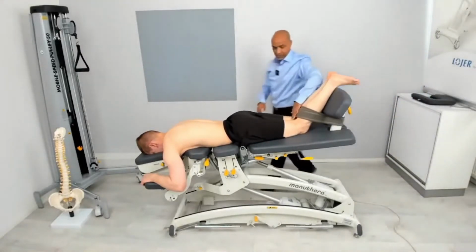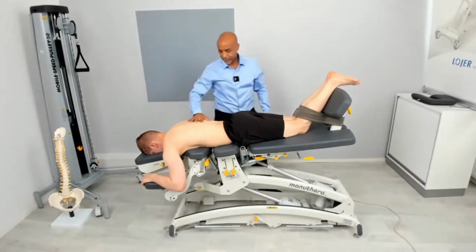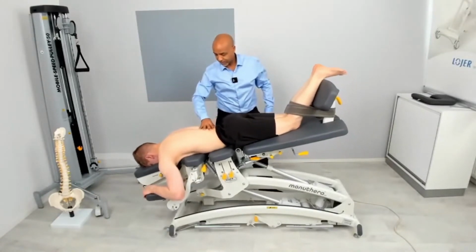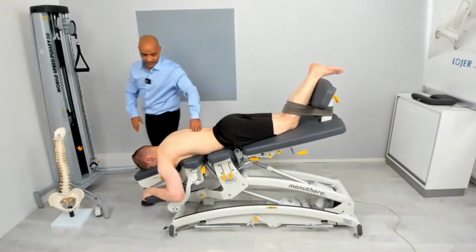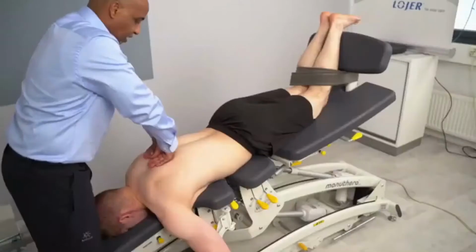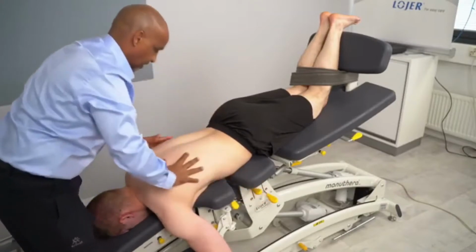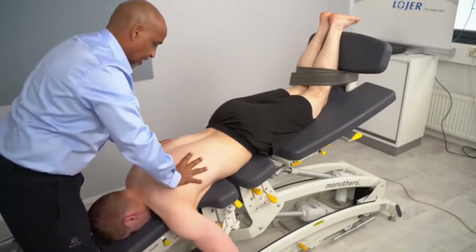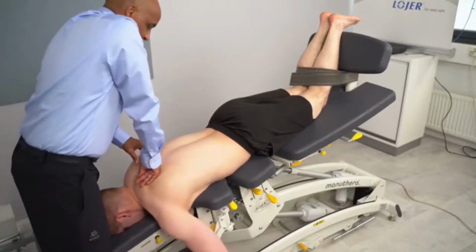This harness will help to increase the range of tilting. So now I have added more traction in this particular area. This will assist gravity so that we can now mobilize those particular joints. By activating this lateral flexion with the assistance of traction, I can add more movement.